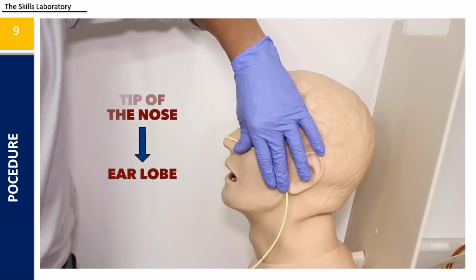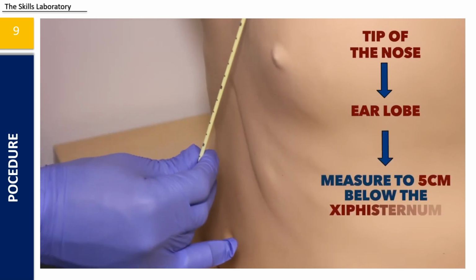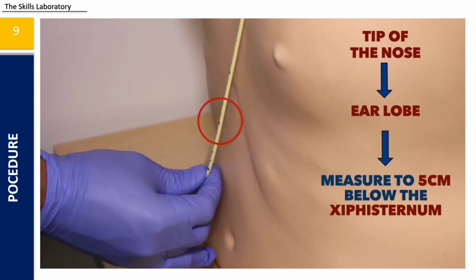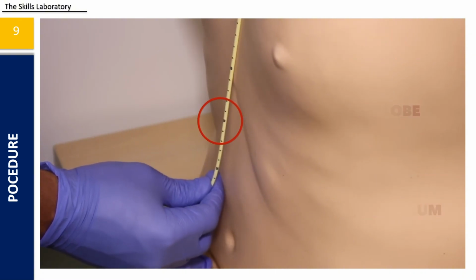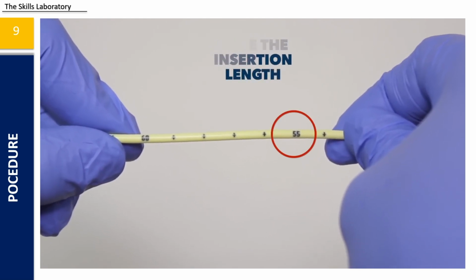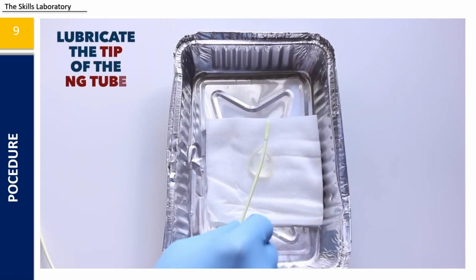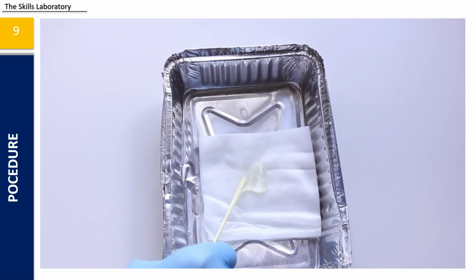Okay, this is very important. In this part of the procedure, what was noted here is your NEX, your nose, ears, and the sternum or xiphoid process. However, we use NEMU. You take note of the length. However, upon measuring, you have to take note that you don't touch the tube to the skin of the patient.